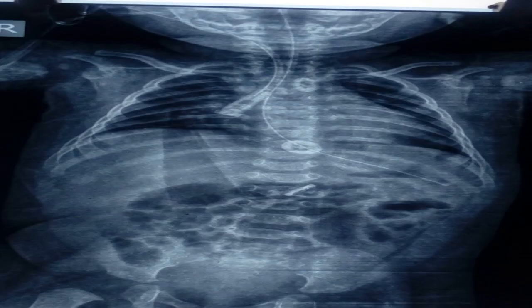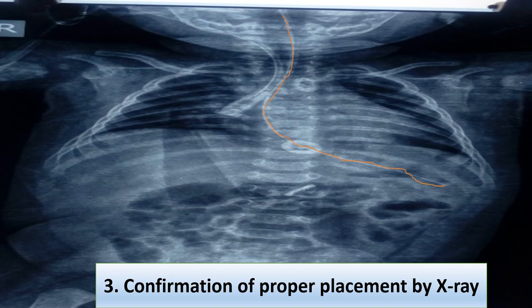Another method is x-ray, which is the best method to confirm NG tube position. In this x-ray you can see the NG tube is visible, showing its course and the tip in the stomach. Another method is to place the proximal end of the tube in a glass of water — escape of air bubbles indicates the tube lies in the trachea, not the stomach. These are the various methods to confirm proper placement.